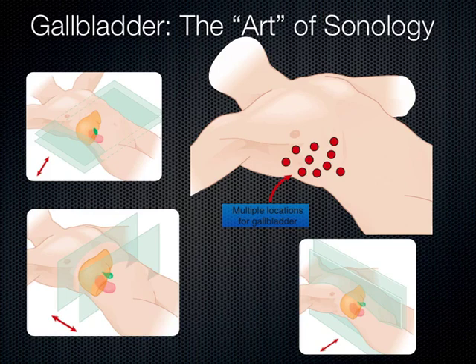And I mean, I found the gallbladder all over the place, and sometimes in older patients, everything kind of sags down. I can see it down here. I found the gallbladder over here before in an older lady. So, generally speaking, these are all the different locations you can dig around and find it.